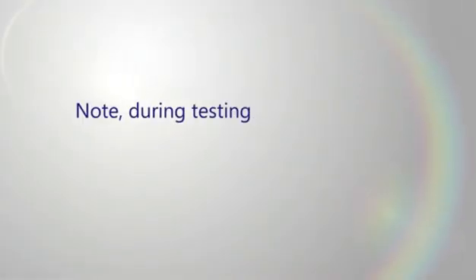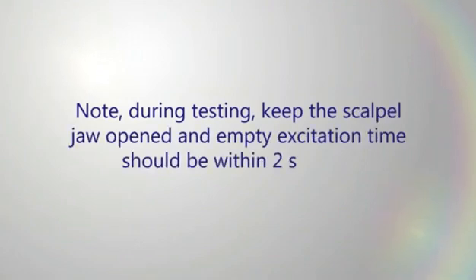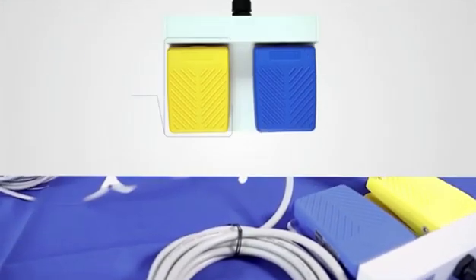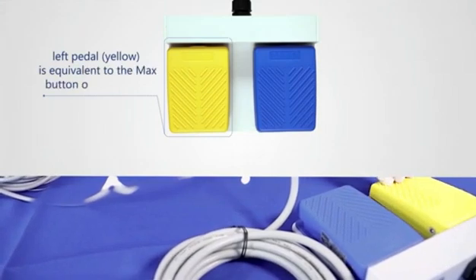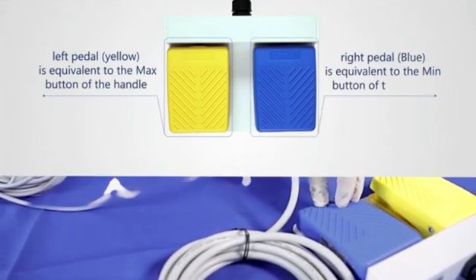Note: during testing, keep the scalpel jaw open, and empty excitation time should be within 2 seconds. Test the foot switch. The left pedal, yellow, is equivalent to the max button of the handle, and the right pedal, blue, is equivalent to the min button of the handle.